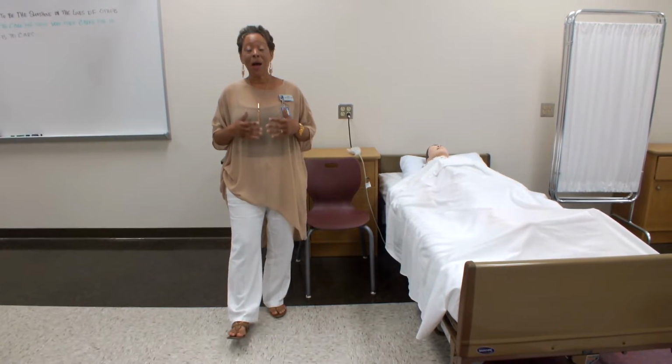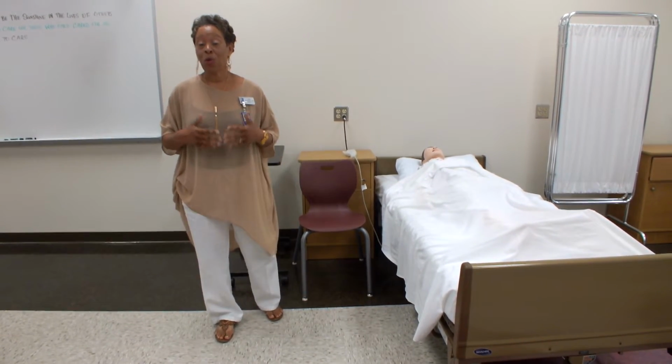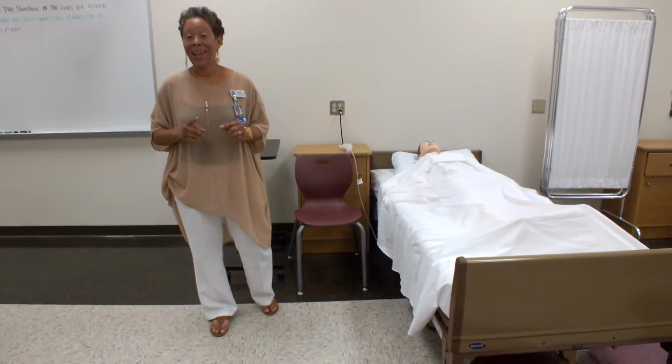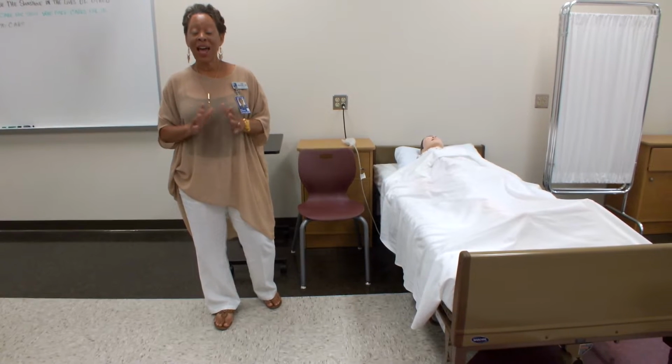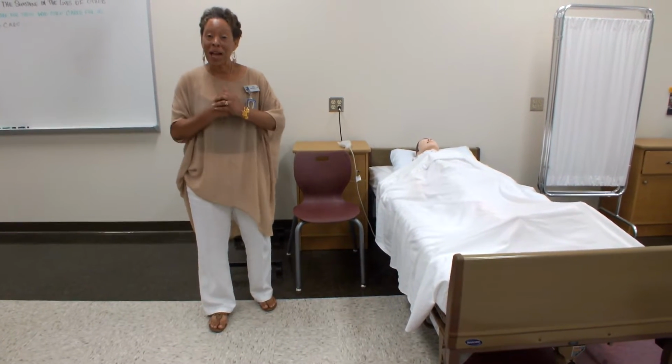In this clip, I'm going to be talking to you about the raising of the head of bed and the chair. Yeah, the chair.